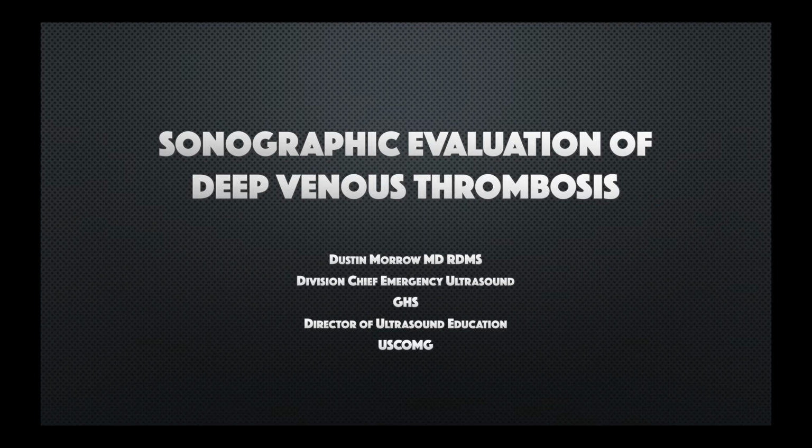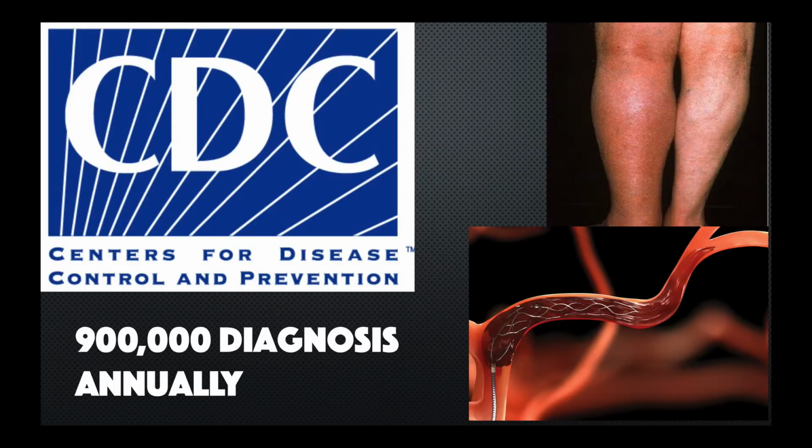Hi everyone, we're going to discuss the bedside evaluation using ultrasound for deep venous thrombosis, or DVT. We're talking about the subject for several reasons. Primarily, lower extremity DVT is the primary cause of pulmonary embolism, or PE.